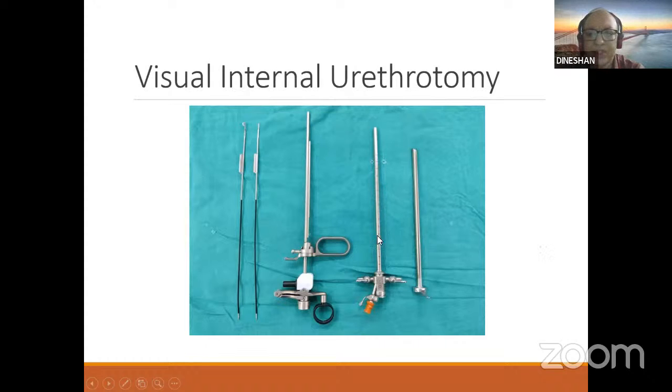It is used to measure the length of the urethra, part of the prostatic urethra, especially in the cystoscope sheath. But those things are all obsolete now, because nobody uses them. Most of the time, you use transrectal ultrasound, but it is customary that questions are asked about why you have all these markings on the sheaths.